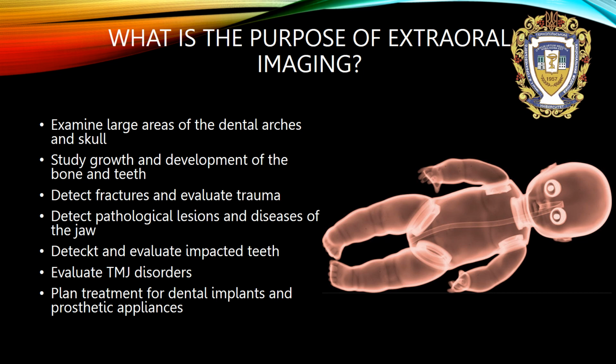Detect fractures and evaluate trauma. Detect pathological lesions and diseases of the jaw. Detect and evaluate impacted teeth. Evaluate temporomandibular joint disorders. Plan treatment for dental implants and prosthetic appliances.